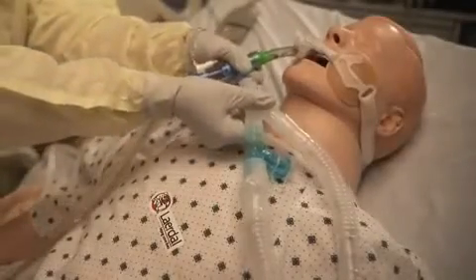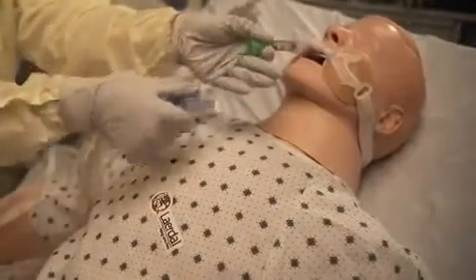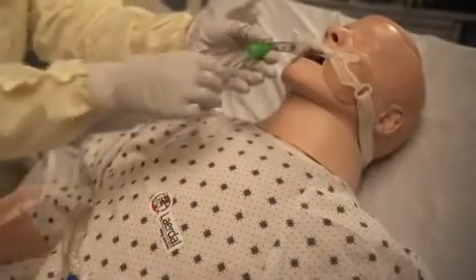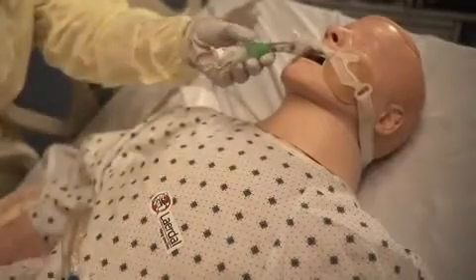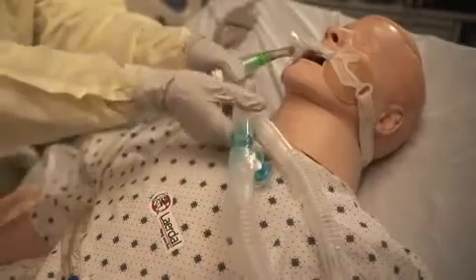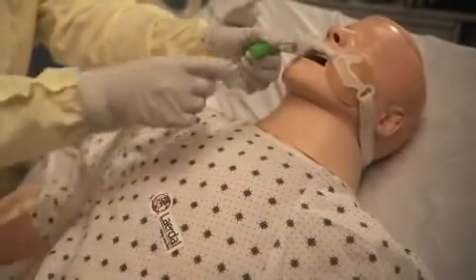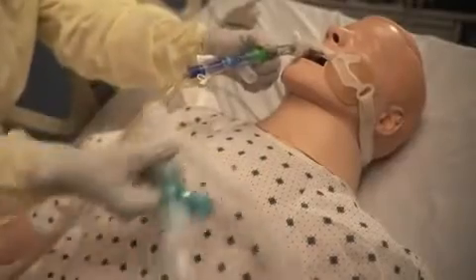Currently, in order to perform additional procedures on ventilated patients, such as bronchoalveolar lavage, bronchoscopy, or drug delivery, clinicians have had to break the ventilator circuit, exposing the patient to contamination from outside pathogens, a leading cause of ventilator-associated pneumonia. This also can expose the caregiver to pathogens from the patient.